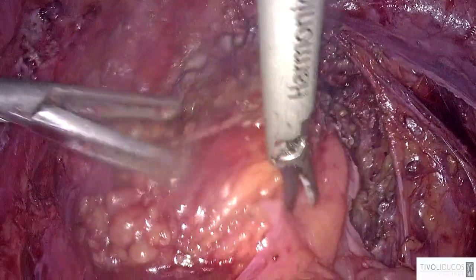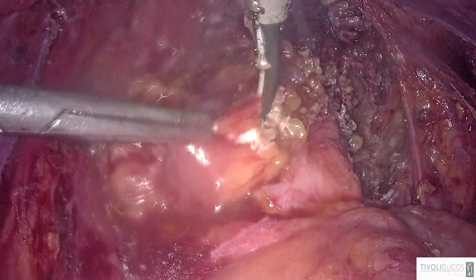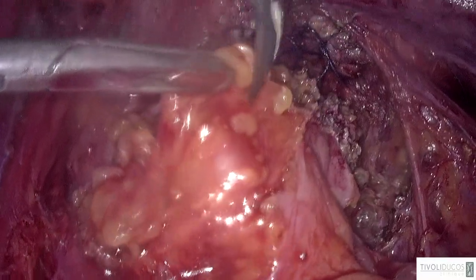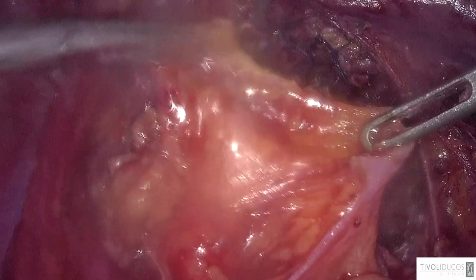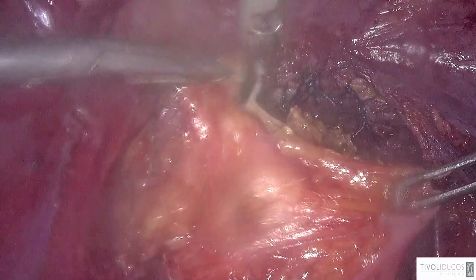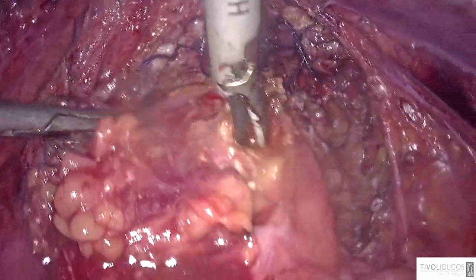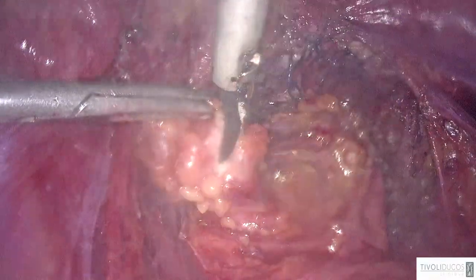Performing the shaving. The third one, removing the fat tissue. The fourth one is putting a stitch. Then pushing the circular stapler, closing the circular stapler, removing the disc, performing an additional stitch, and then the test, bubble test. So I will try to emphasize each one during this surgery.